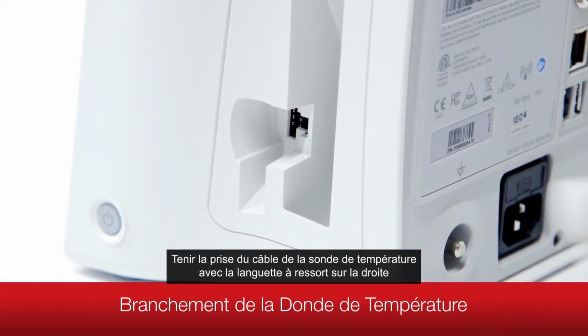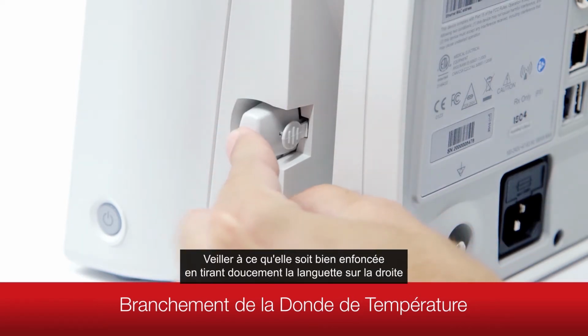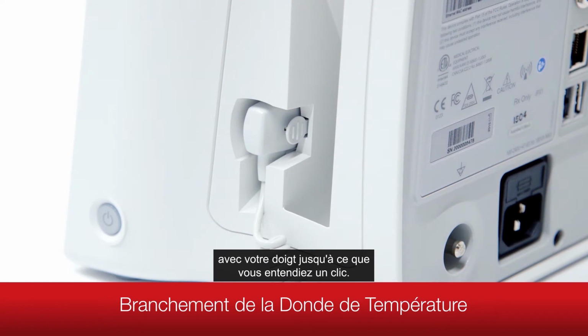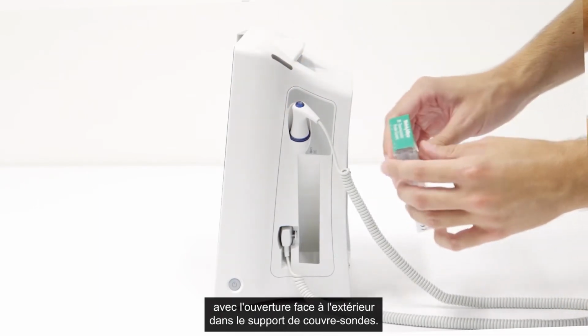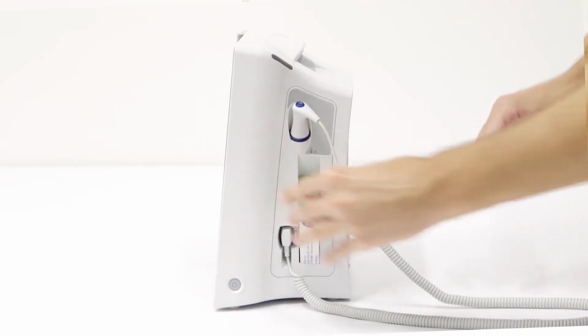Hold the temperature probe cable connector with the spring tab on the right and insert it into the probe port. Ensure that it is all the way in by gently pulling the tab to the right with your finger until you hear a click. Insert the probe into the probe well and place the probe covers with the opening facing outward into the probe covers holder.